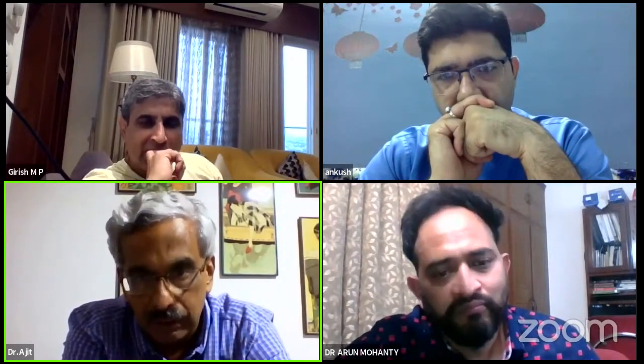The second is post-exam, when you're doing interventional cardiology. Doing interventional cardiology today without imaging inside the coronary is simply like doing transcatheter valve therapy without doing a CT scan. It's guessing a lot of things, and putting the wrong size valve into patients and running into complications. So I feel that if you're running a cath lab and you don't have imaging tools, you're not going to be a good interventional cardiologist, and you're going to get into trouble in the cath lab at some point of time. So at least one or two of these tools, and fractional flow reserve, are mandatory when you start your cath lab, along with your angiogram.